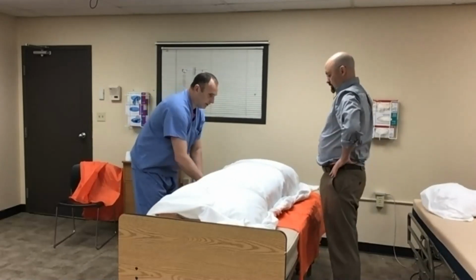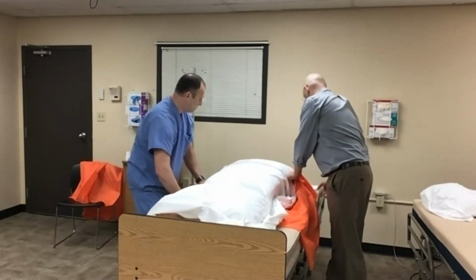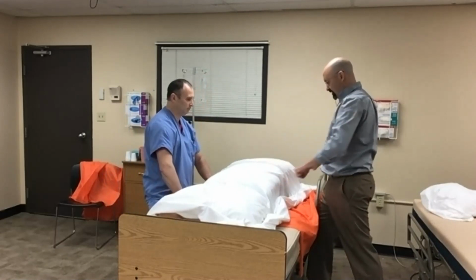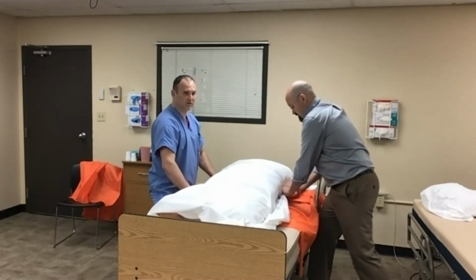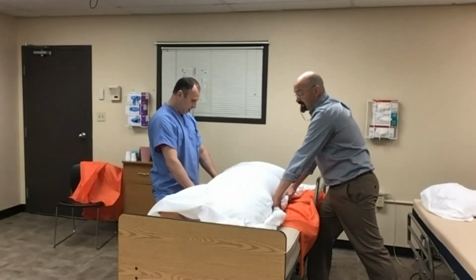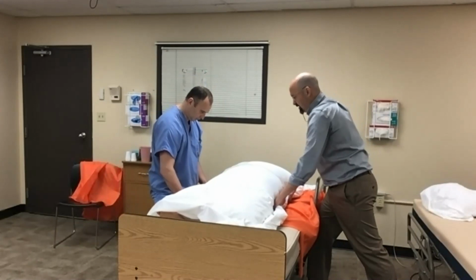We're going to re-burrito. I'm going to put the handrail up on my side. You're going to see why. Because when I come across, I'm going to use that handrail as a guide to have the patient come right up on the side. Now when I'm doing this, because it's just me, I'm at shoulder blade and pelvis, so I'm getting most of the trunk. And again, you would be having no less than 7 people, 6 people on either, 3 people on either side, and then 1 managing the airway.